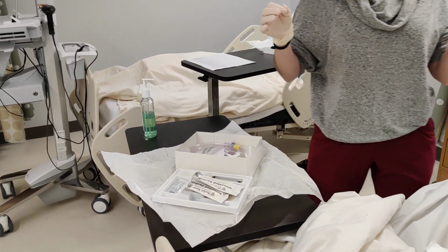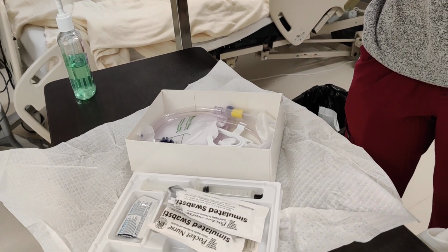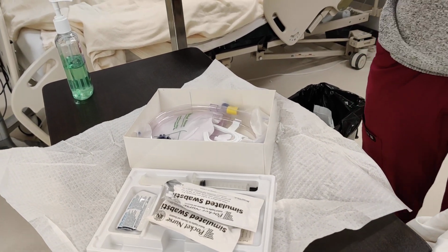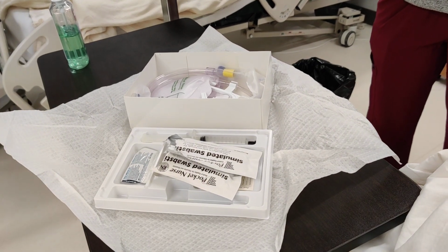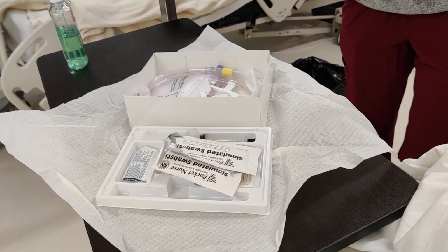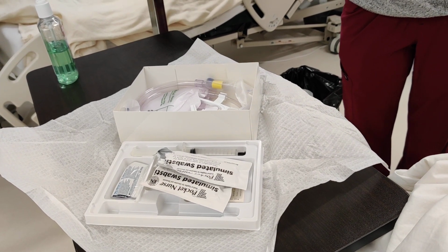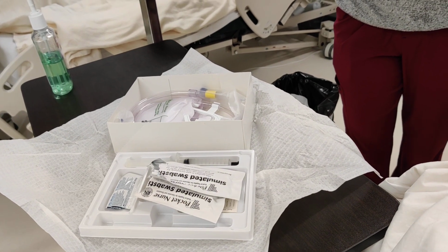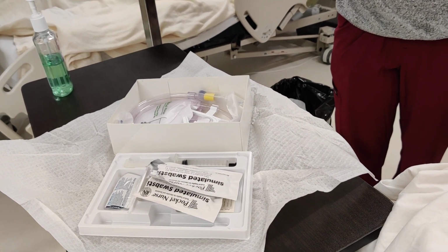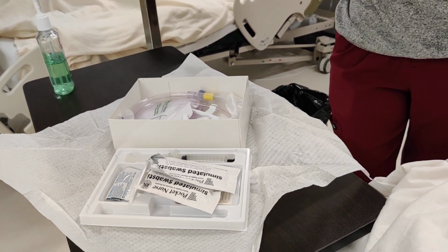All right. So just to show you what this kit looks like, that bottom cardboard container contains the Foley bag and catheter itself. And that top section, once again, has those swab sticks, the lubricant, and then a syringe that's pre-filled with either normal saline or sterile water. That's what we use to inflate the balloon once it's in the bladder.